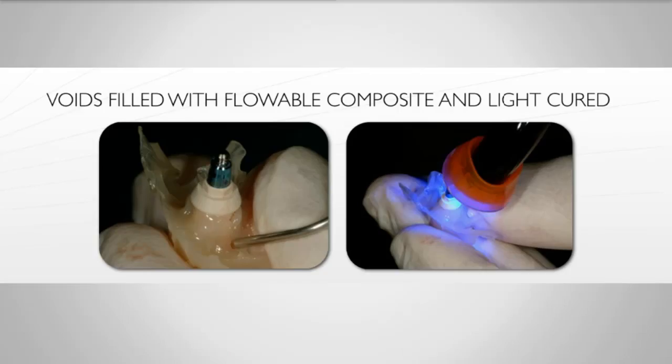So you're going to get a little void around here because the tissue is going to collapse, but that's where you want the support. That subgingival support is what's so critical. So you add flowable composite there and set that quickly with the light.